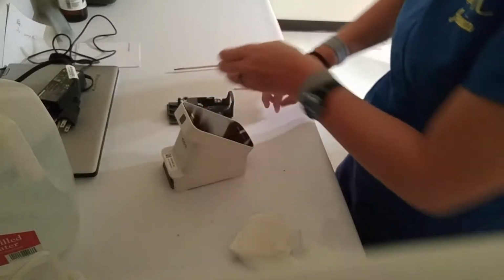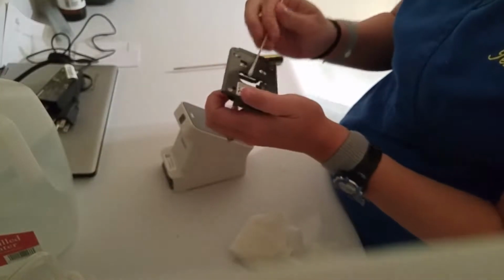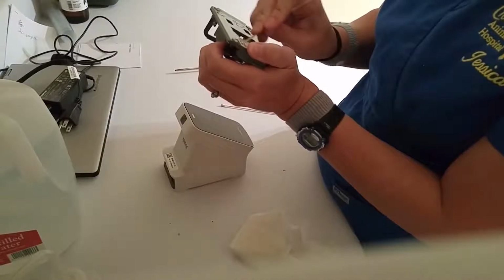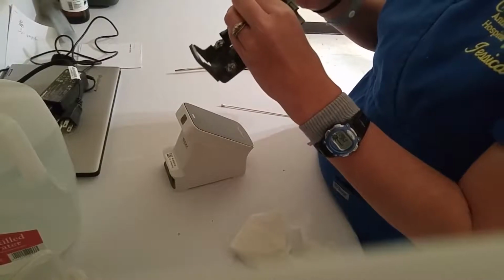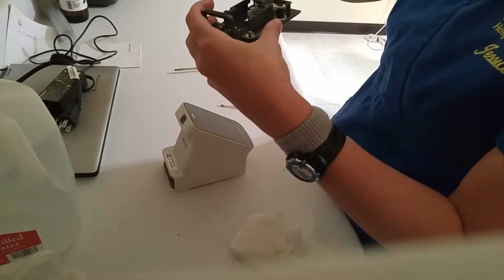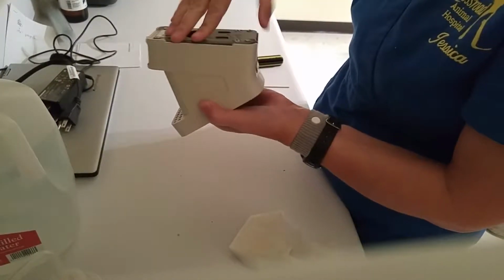We'll go ahead and turn that over. And I'm going to look at this part here. I'm going to flip it over. Make sure that this area is also clean of blood. I'm just using some alcohol on some Q-tips to make sure everything is clean. Make sure everything functions well, nothing sticks. Everything moves pretty freely. Go ahead and stick this back in here.